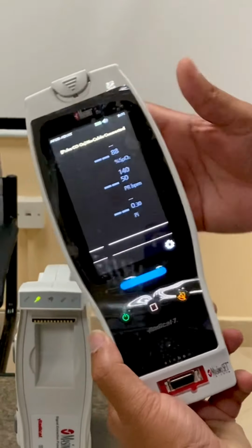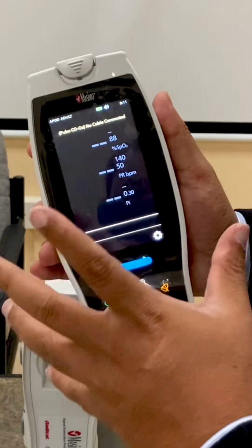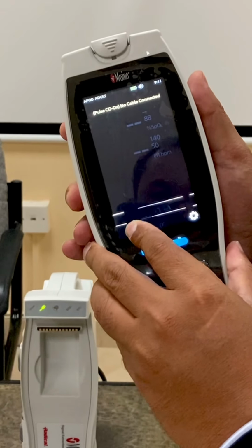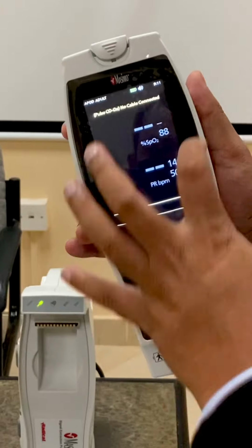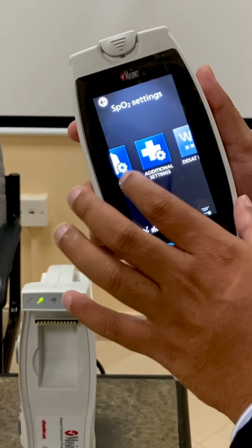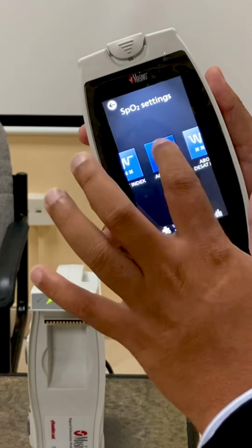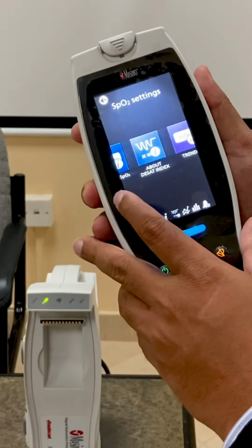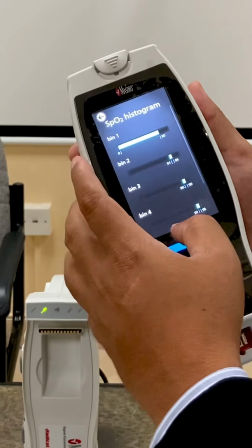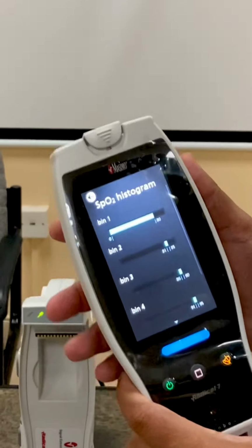The other good thing is, if you don't need to see the pulse rate in a bigger way, you can go here and just drag it down so that it will be down, and you will get this one. If you press on SpO2, you will get the alarm limits. You can just go in, and then the trend and histogram. In the trend, you can see the previous readings, probably 2-3 hours previous.